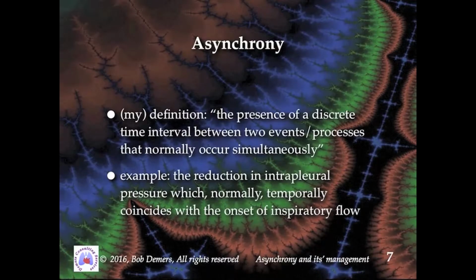All too often, mechanical ventilators are observed to be out of phase with the patients to whom they are interfaced. This is a worrisome event when observed clinically, and a dysfunction that can impose an enormous workload on the patient. This presentation explores the physiology and respiratory mechanics pertaining to asynchrony and discusses several strategies which can be implemented to counteract it when it is encountered in actual clinical practice.